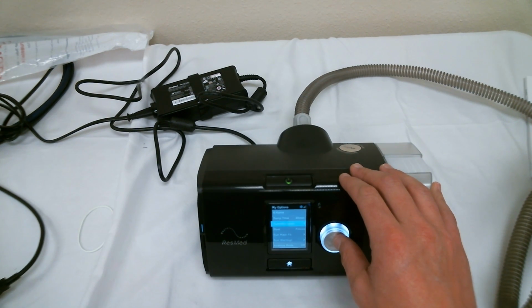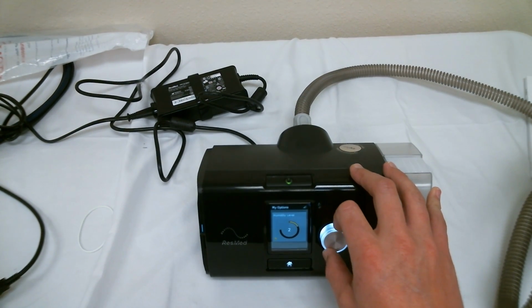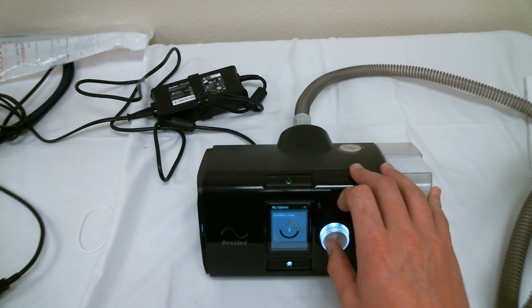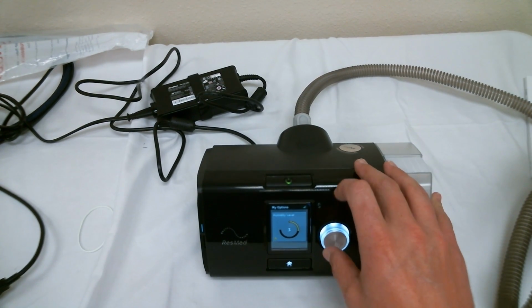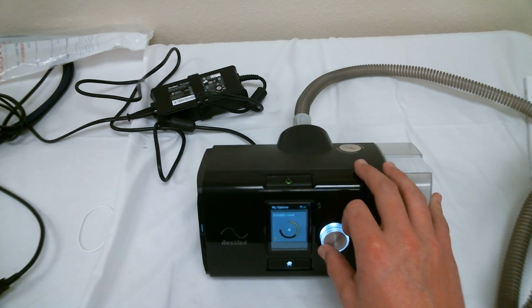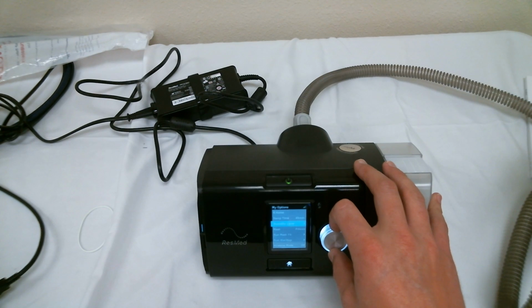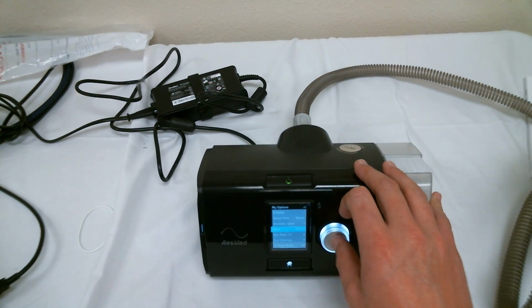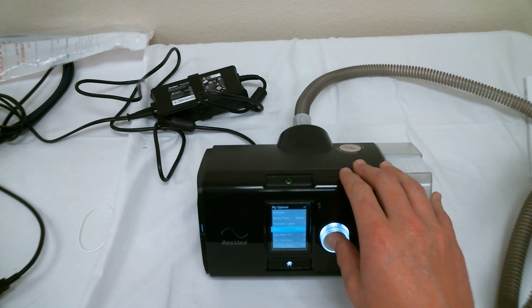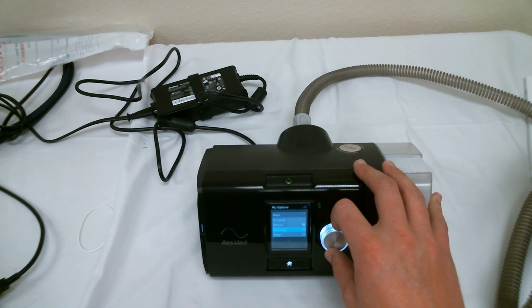The next option is your humidity level. It ranges from off to a maximum of 8 and should be adjusted to your comfort. If you wake dry, turn it up a notch. If you wake to find excess condensation or water in your tubing or mask, turn it down a notch. Press to confirm once you've made your selection. Next, you have your mask option. It should be preset with the mask that was shipped along with your machine. But if you use a different mask or change masks, please change it in your menu as well.